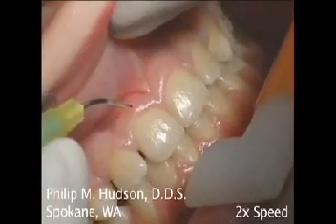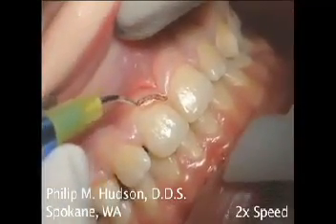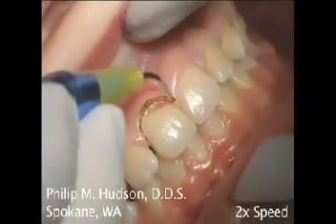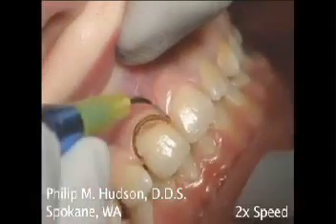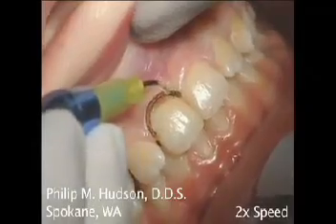Dr. Hudson begins by indicating with a laser or a Sharpie pen where the height of contour is on the free gingival margin of the tooth to receive the gingivoplasty. He then carefully freehands a superficial line on the surface of the gingiva. He then works in more deeply along the line created through the gingival tissue to the underlying enamel.